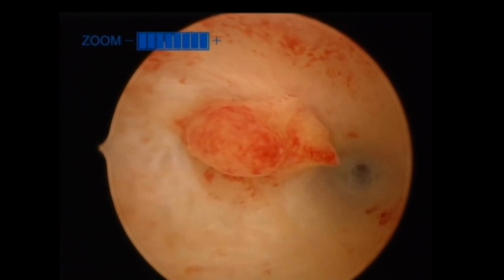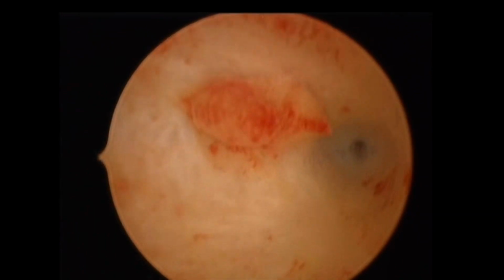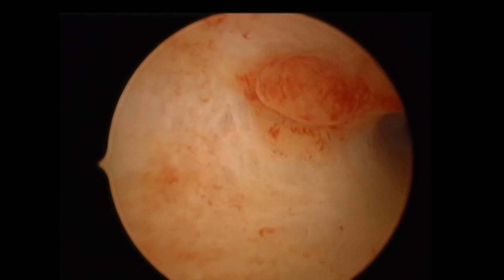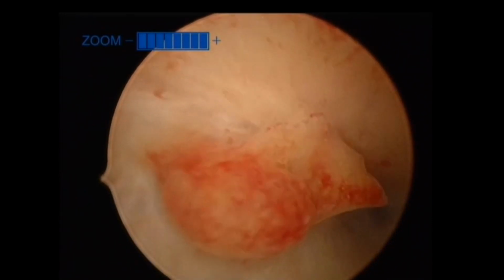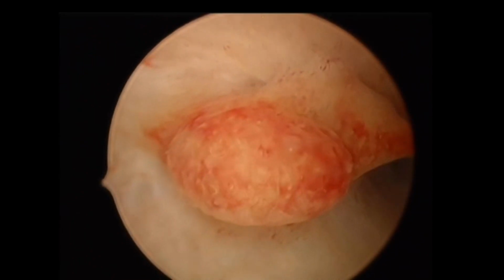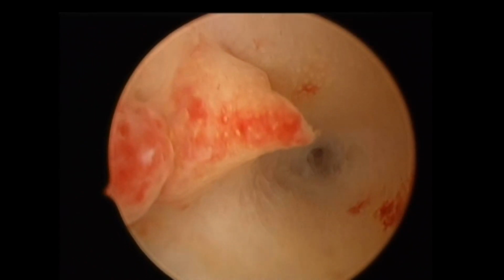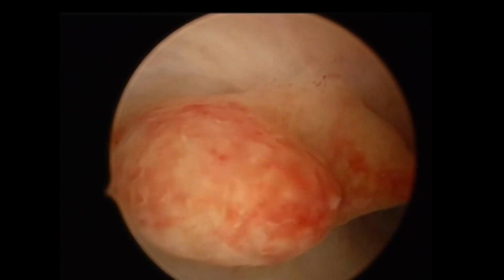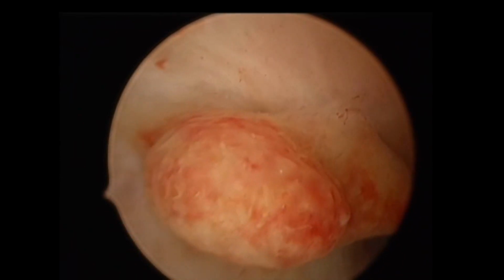And please look at this endometrium. As I always repeat, gynecologists should have well-trained eyes to look at the endometrium and identify its nature. By time and repeated, frequent examination of the uterine cavity, you will be able to know the pattern of the endometrium. Is it proliferative or secretory, hyperplastic, or atrophic, like this one.